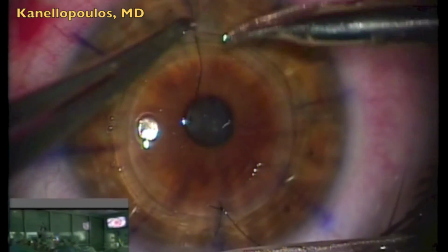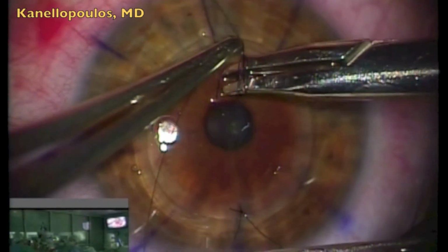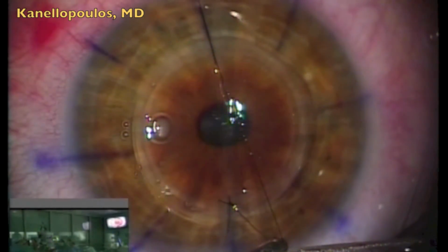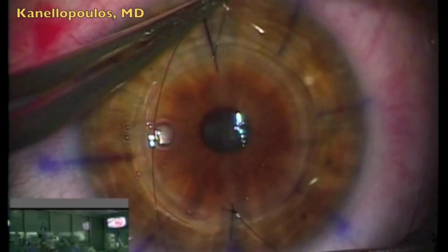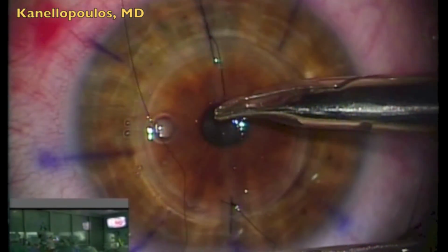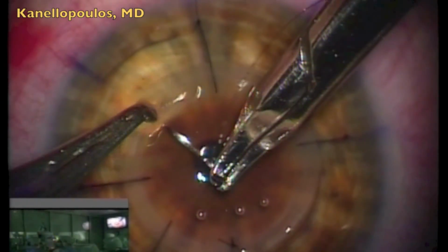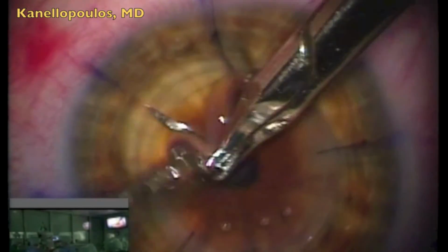Very important part here for beginners in keratoplasty, to have an equal distribution of the strength when we pull down the suture and tie this knot in the middle. I just picked this particular suture as indicative of the pressure needed to be put in. Again, a manual surgical technique even in today's date with femto-assisted surgeries.